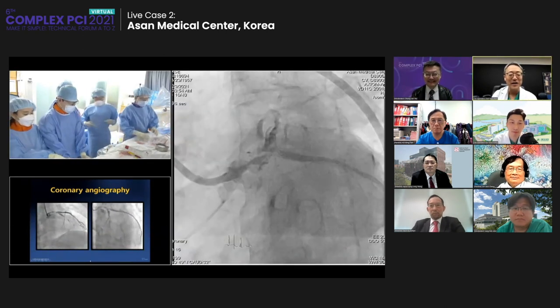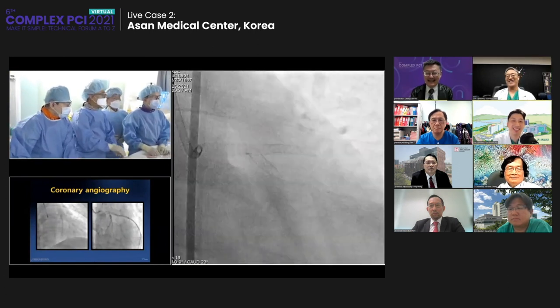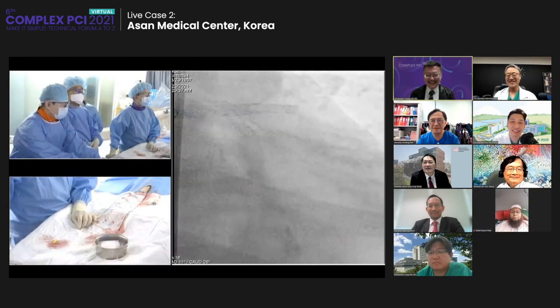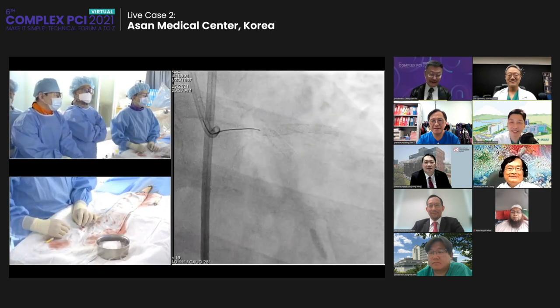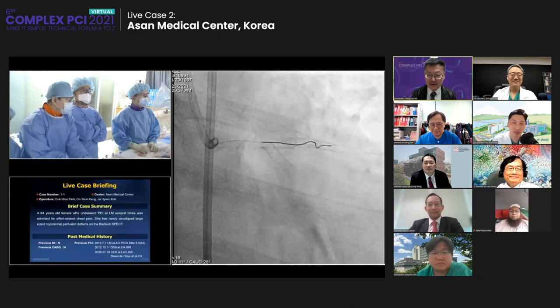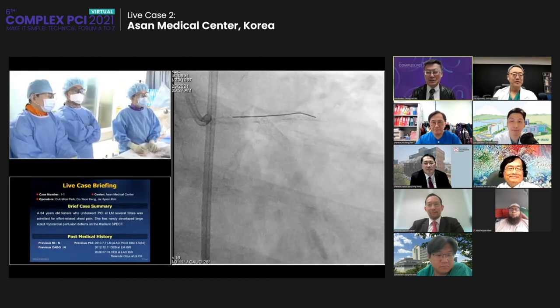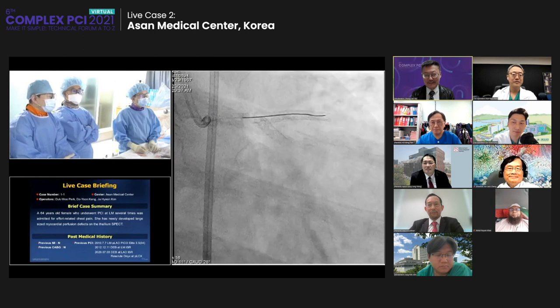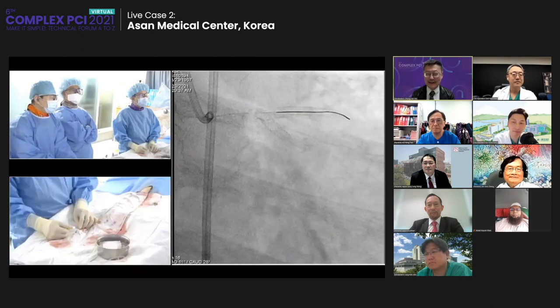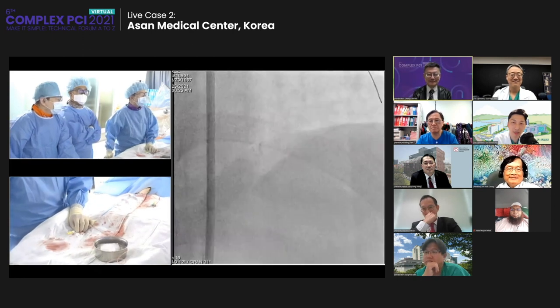I think, frankly speaking, from here your recommendation is bypass surgery. It's a soft wire. Because of neoatherosclerosis for that long time, we will be expecting very complex neoatherosclerosis. Even you can face some very severe calcium, so debulking would sometimes be very necessary. Yeah, that's like the big size rotablator as Dr. Park showed us in the PCI complex maybe 2 years before, later, let me see ISR.